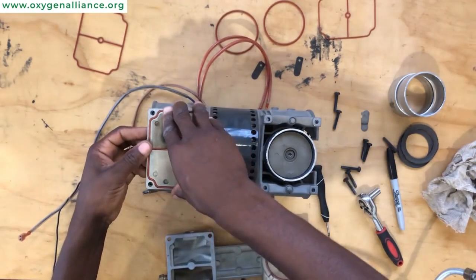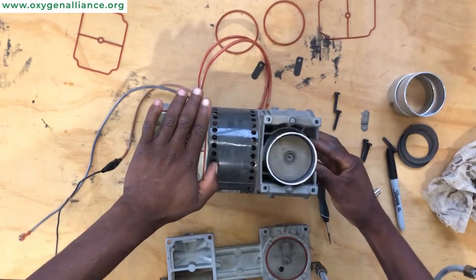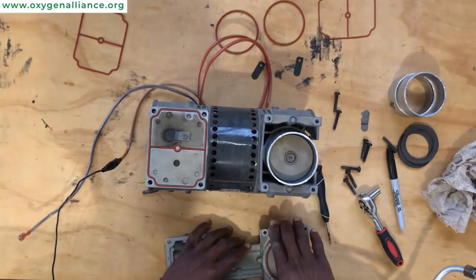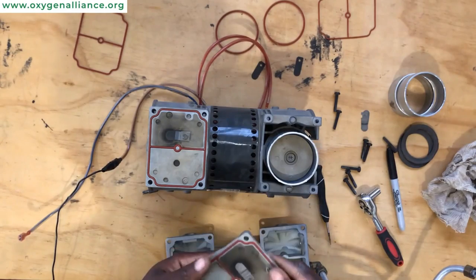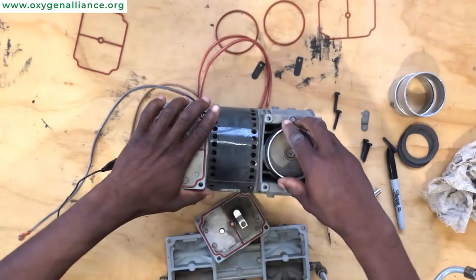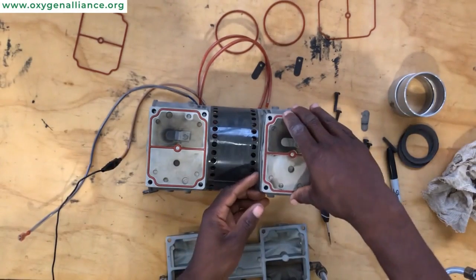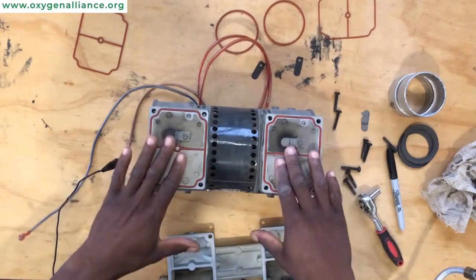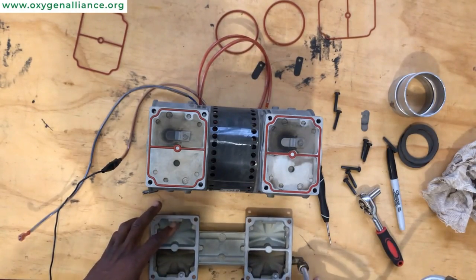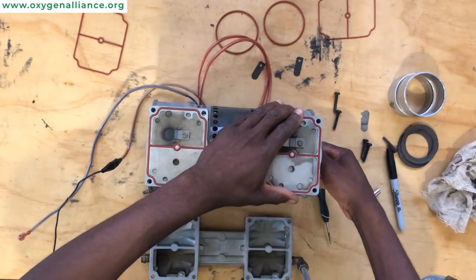After that, you can place the valve plate on top of the cylinder sleeve. Once you feel it is in place, you can place the second valve plate on the other side. Now that we have our valve plates on top of the compressor, try to rotate the compressor and make sure that everything is rotating nicely while holding down the valve plate.